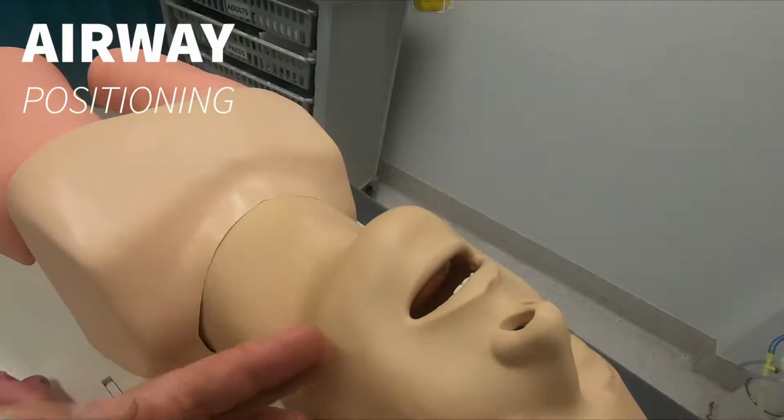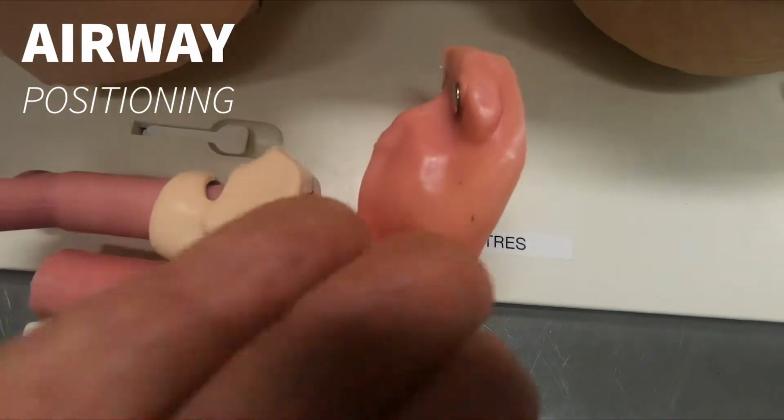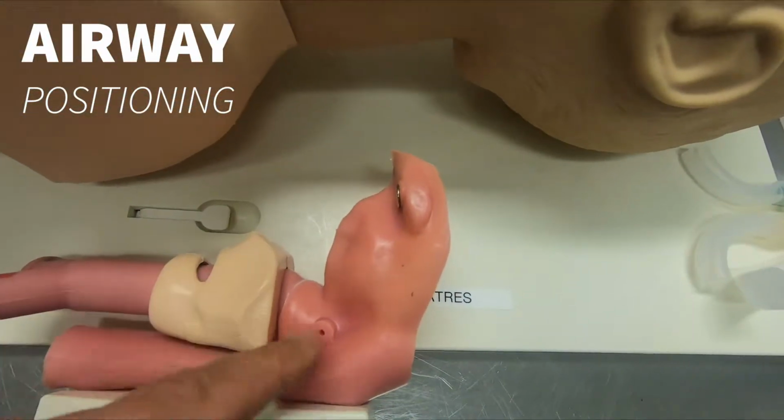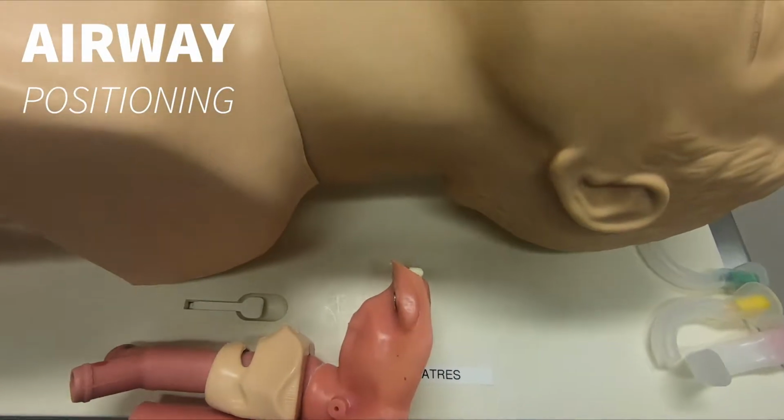I see a lot of people moving it forward, but we want to lift this up, because when we lift it up like so, we are straightening out this bend, which makes it easier to see the airway.